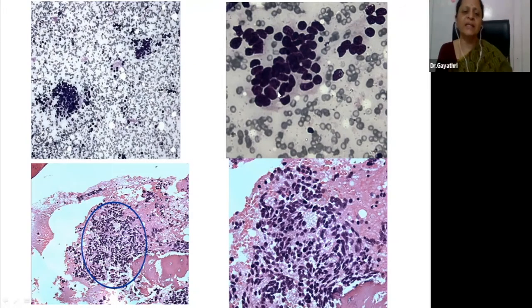So when you see clusters like this, if you are lucky to find them on a marrow aspirate smear, or maybe better in a biopsy imprint smear, you should think about whether these are lymphocytes or non-native, non-lymphoid cells, which is metastatic round cells. Since metastatic round cell tumors can be missed because of their morphology, aspiration alone will not be sufficient. Also, all metastatic lesions require biopsy, because otherwise focally distributed lesions will not get picked up by aspiration alone.